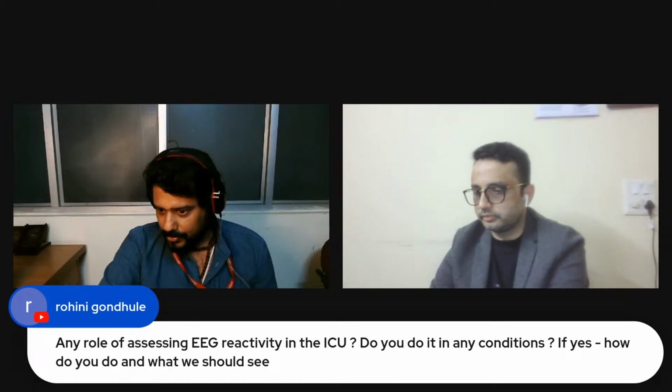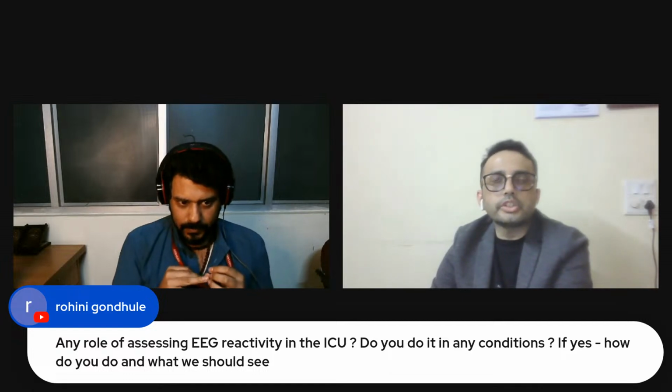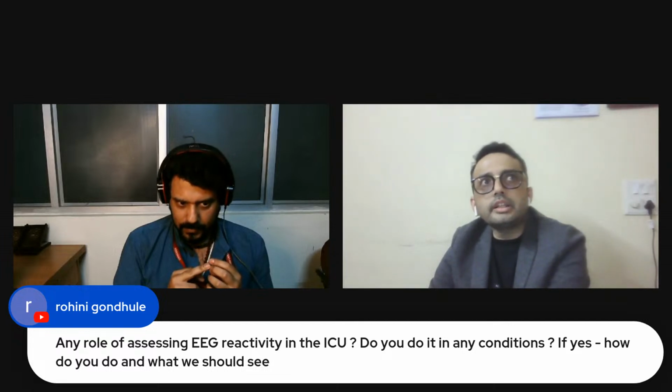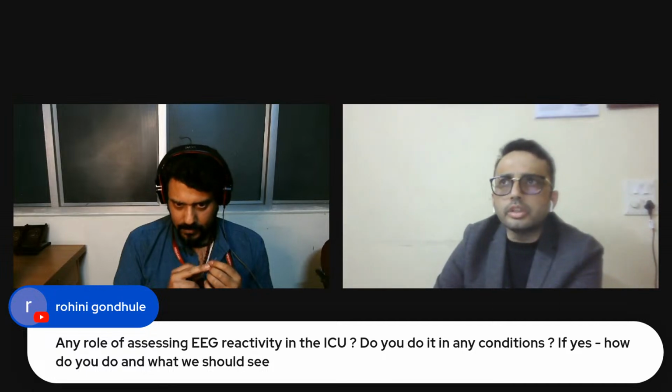If yes, how do you do it and what should we see? Definitely, it's a very good question. Based on the reactivity, we can grade the encephalopathy as mild, moderate, and severe. In the case of mild encephalopathy, we will see reactivity, like reactivity to eye closure and eye opening.